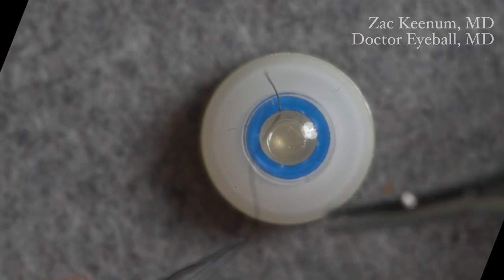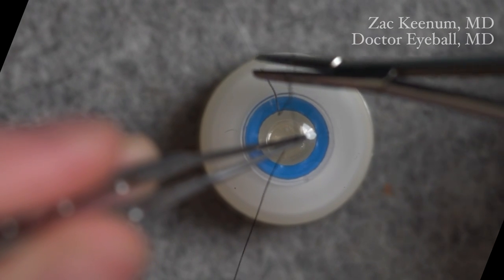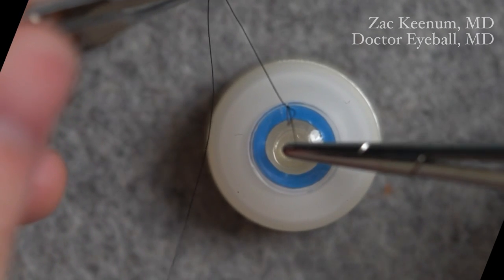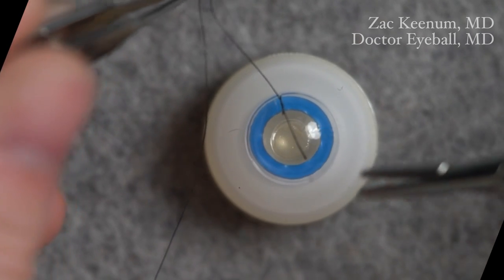Now let's get into how to actually do the slip knot. I'll grab with my left hand, going from inside between the two sutures — so inside the loop — and cross here. That makes a square first throw.